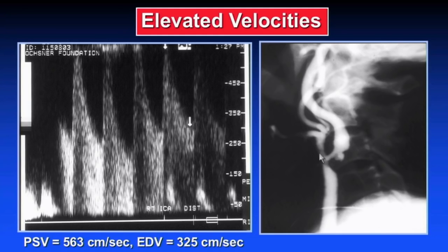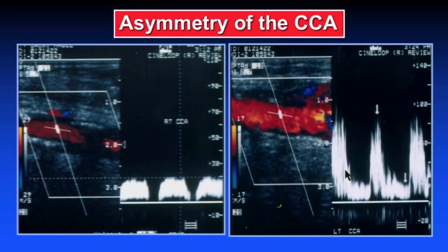And it also demonstrated, as we saw, the ulceration, but again, we knew it was heterogeneous plaque, so we knew it was potentially unstable. That's why we were moving forward with a process.